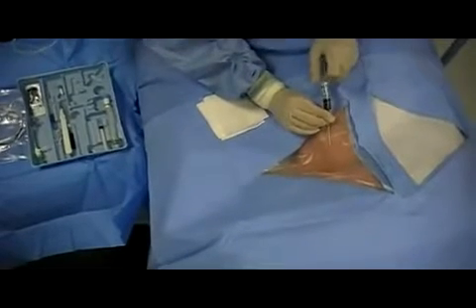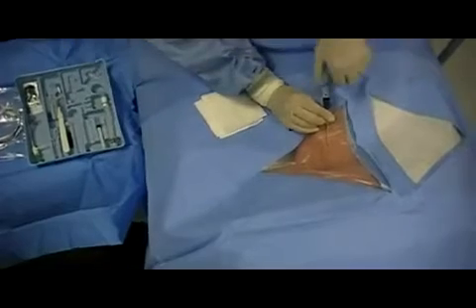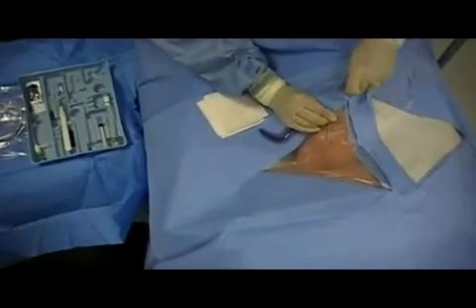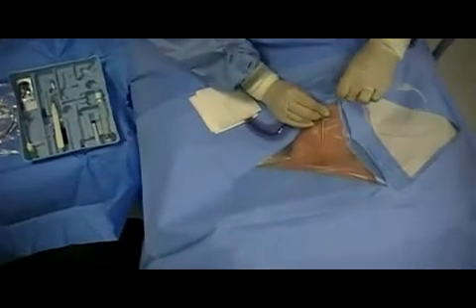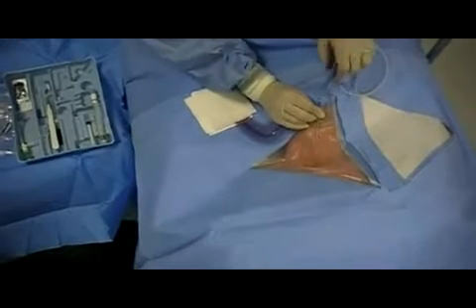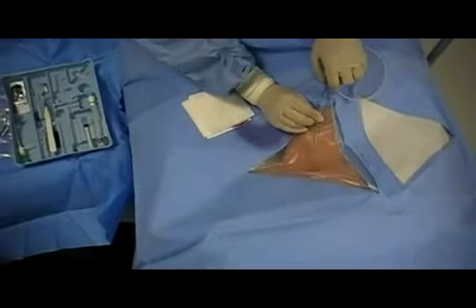The needle is inserted until a flash of blood is obtained. Two common sites for temporary transvenous pacemaker insertion are the right internal jugular and the left subclavian veins. However, there is controversy about the left subclavian, as this site should typically be preserved for permanent pacemaker placement.